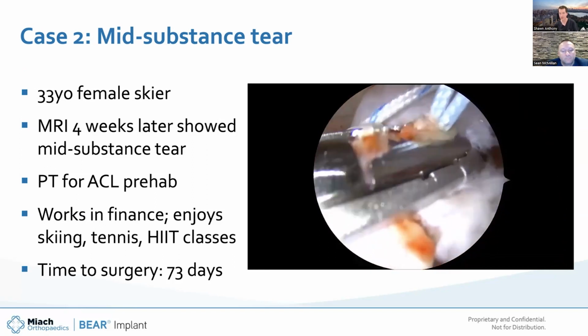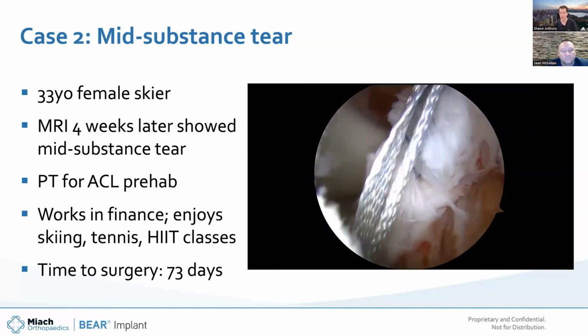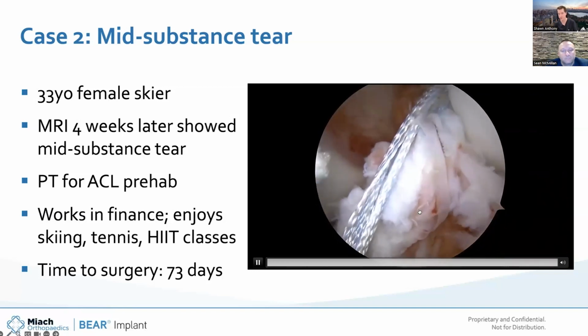But using the elongation techniques, as Dr. McMillan showed, you can get excellent control of that ACL stump. So in this example, I used a modified Bunnell type suture with an ultrabraid suture, passing it back and forth up through the stump. And even in this example, where at the initial scope, I put the camera in and it looked like there wasn't much tissue left to work with, you can see after working with that stump, you can almost get near approximation of the end of the tear back to the femoral wall.